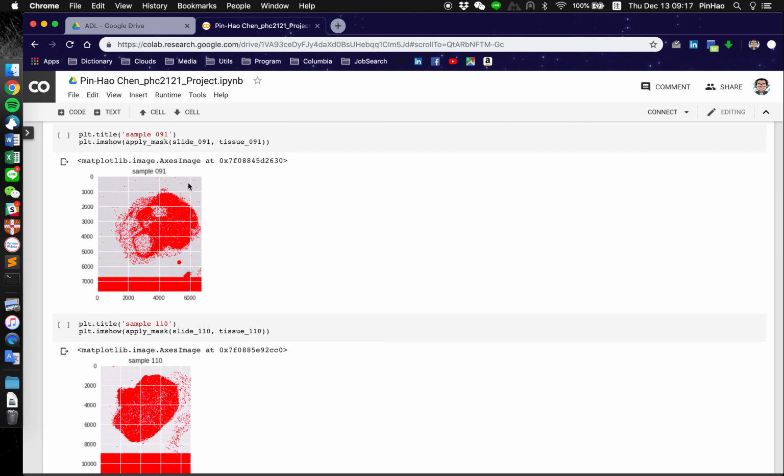Since all the images have lots of noisy points, like these gray areas that don't have any cells, we want to focus on where exactly the cells are when we cut into patches. Otherwise, we will create lots of unnecessary noisy patches.